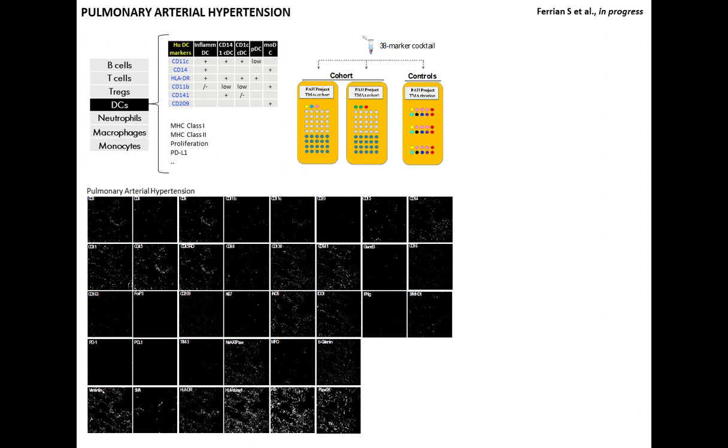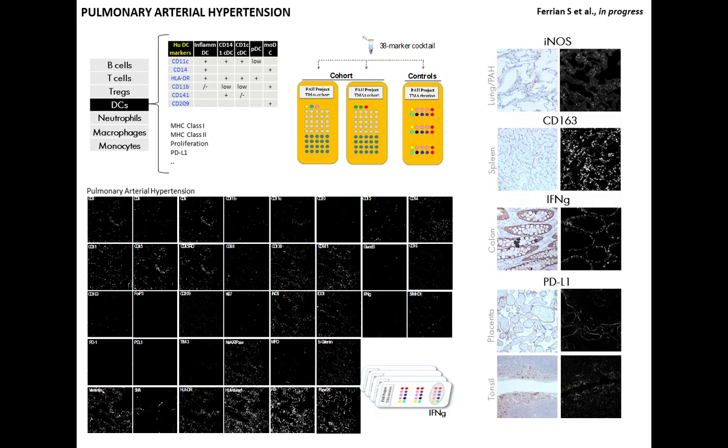The patient cohort and tissue control were stained simultaneously and analyzed by MIBI. The final testing is performed and evaluated on the same TMA by single-plex IHC, where the antibodies that show expected results across different tissues by immunohistochemistry were compared to the MIBI expression pattern, in combination with visual comparison of marker co-expression.